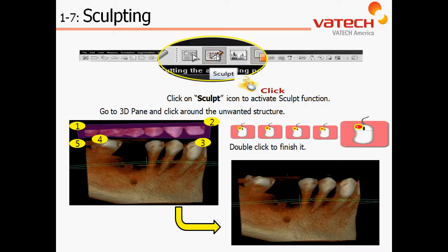Simply left click to activate it, and then through a series of left clicks, draw a shape around the area to hide or mask. Clicking once on top of the shaded area will then mask that anatomy from view.